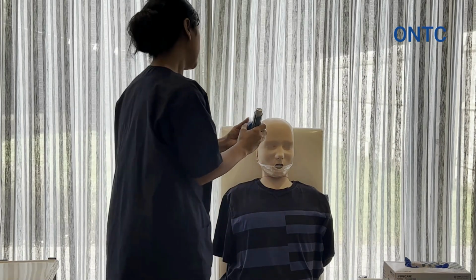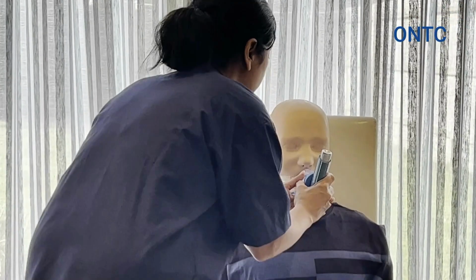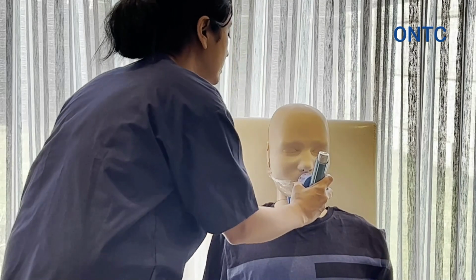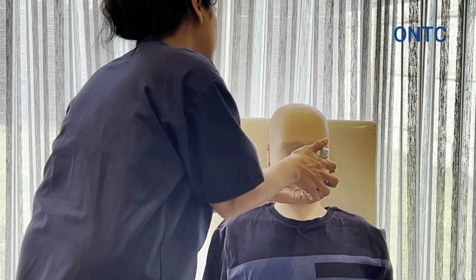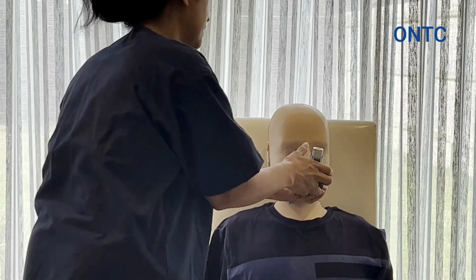You can exhale and then grab the mouthpiece into your mouth, make a seal with your lips, and okay, now start breathing deeply in and out. Okay, you started breathing deeply in and out. Just tip your head back again, and I'm going to press for your second puff. Okay, you tipped your head back, so second puff now.